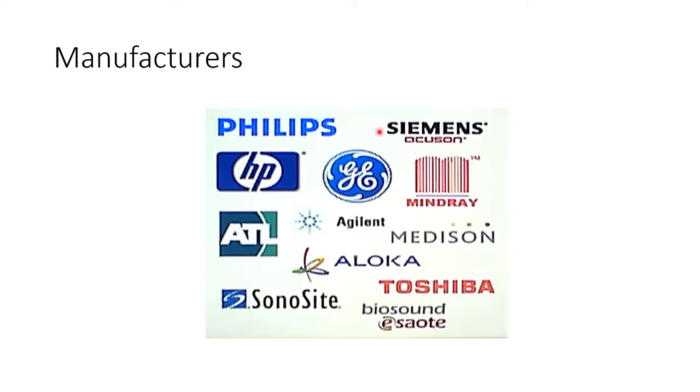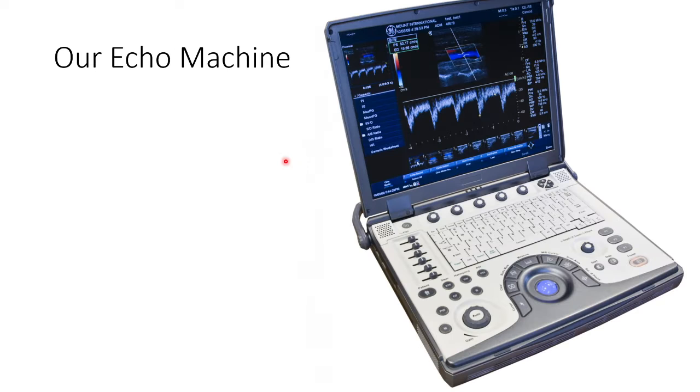There are various echo machine manufacturers. In our hospital, we use mainly the GE machines, and in our ED we have the Sonosite. Other machines also work on similar optimization techniques. The lecture which I'm going to give will work for almost all these manufacturers, but there will be a slight change in the terminologies.